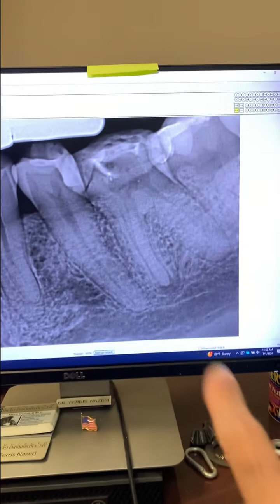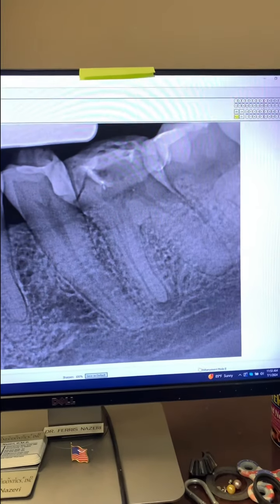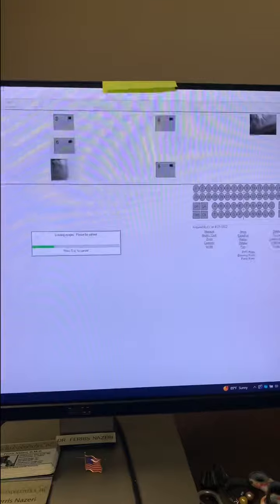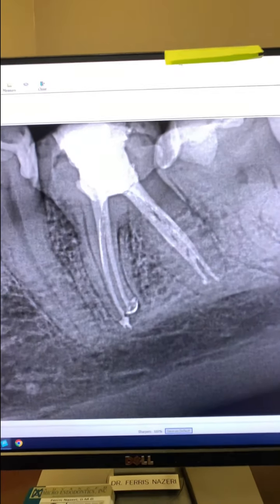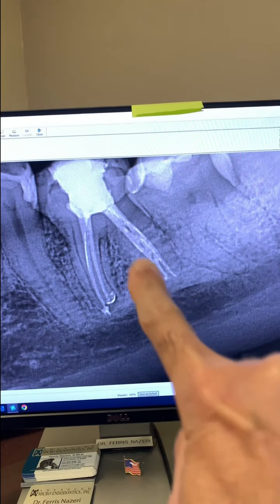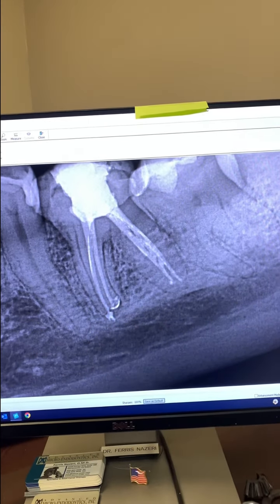All right, so you can again see the periapical lucency. And we did this root canal in 1 appointment for her, and take a look. So IV sedated her and did the root canal for her in 1 appointment. And here's the post-op, so you can see 4 canal systems, 2 mesials, 2 distals. You can see all of that anastomosis also. You can see some sealer puff here.